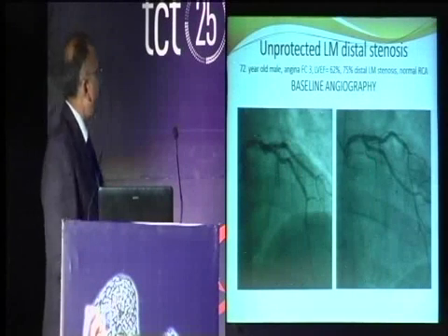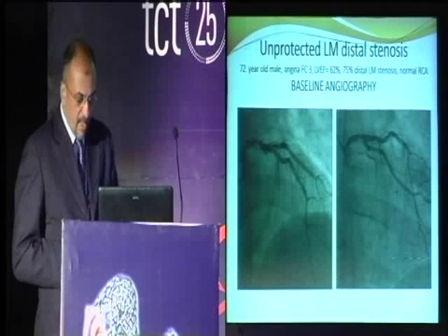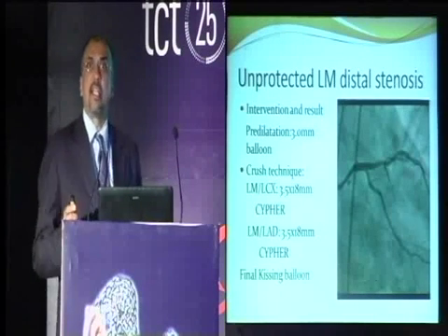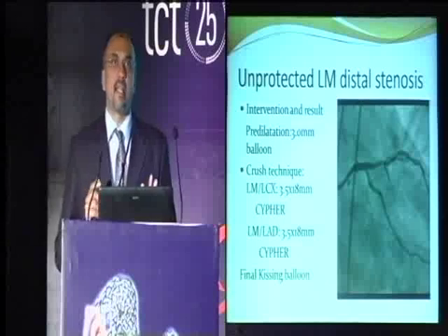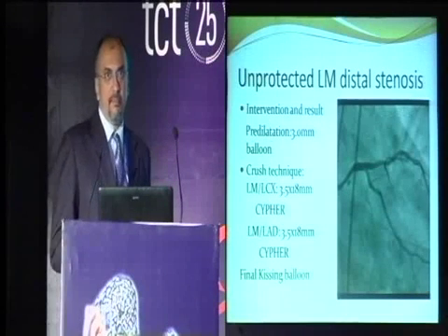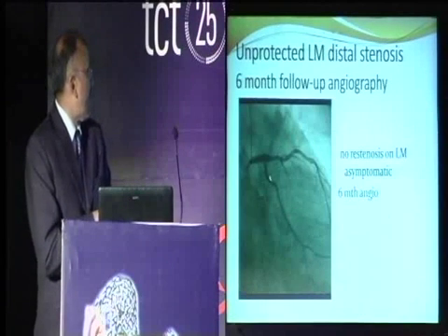And now, when you come to an unprotected left main with a distal bifurcation, with some circ involvement, then if the left main is not big, this strategy would be a crush technique. Actually, a mini crush would be an ideal technique here, and the results are quite gratifying.